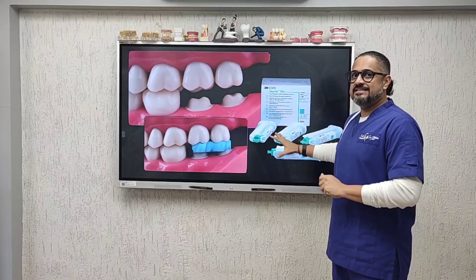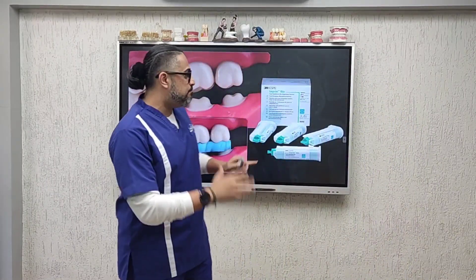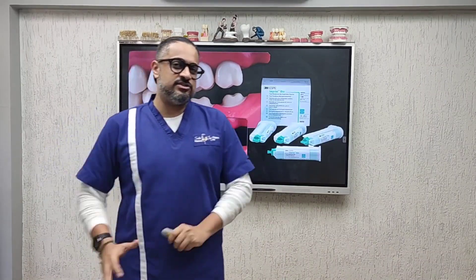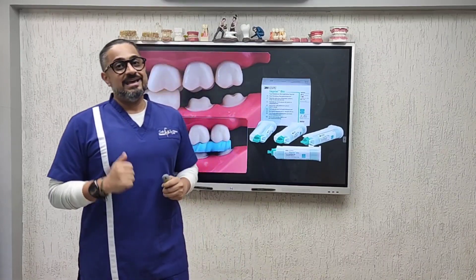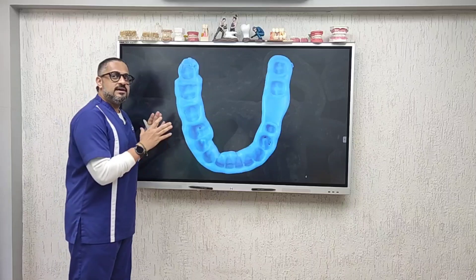It should also be made in a material designed for bite registration. What you see on screen here is Imprint Bite — an addition silicone bite registration paste from 3M that I personally prefer to use in my practice.